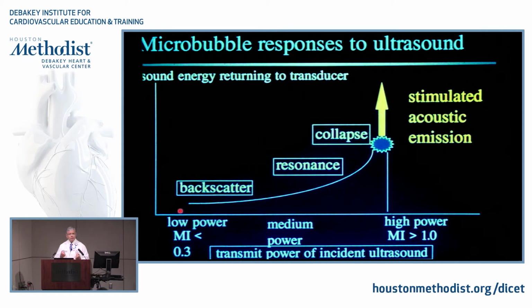So number one is know your mechanical index, know your settings on the machine itself so that you're using an appropriate mechanical index. For most visualizations currently, the mechanical index with contrast should be low, 0.5 or below, 0.5, 0.4, 0.3, or something like this, so that you don't destroy as much, okay? Let's take a look at some examples here.